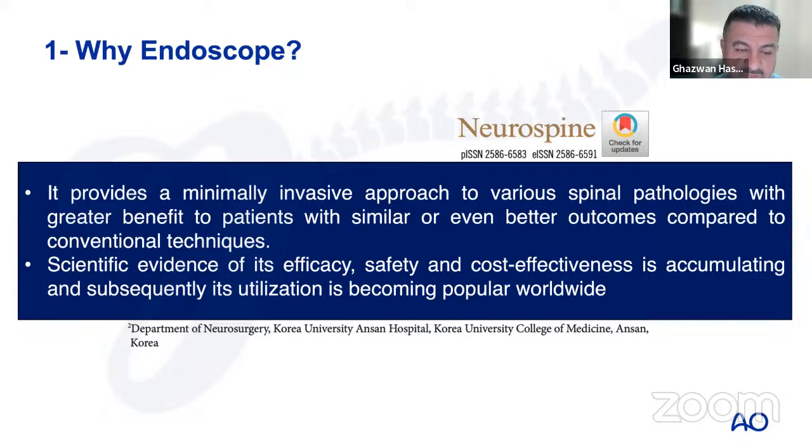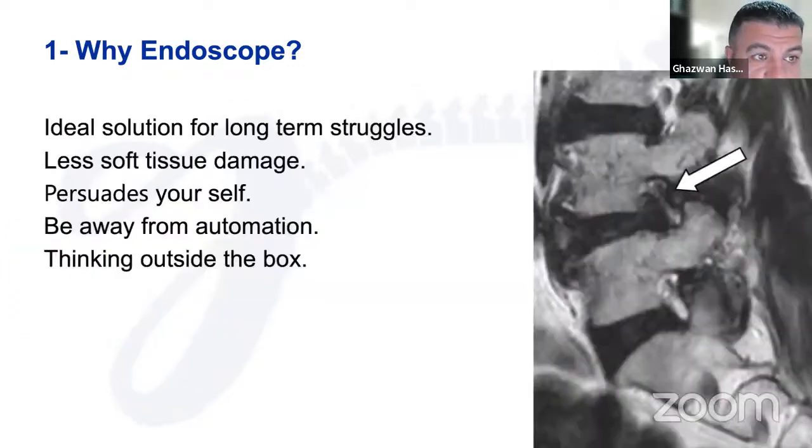in the long term there will be more innovative techniques, as my friend presented now with cases for revision surgery. Before, they only started to do endoscopic spine surgery for simple disc herniation, but right now with endoscopic spine surgery, they can do everything.